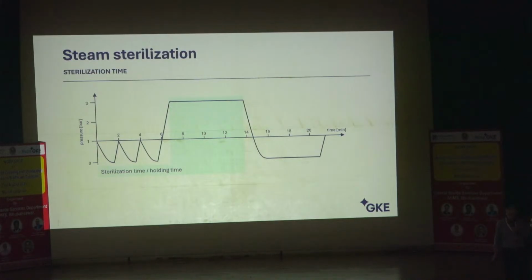Sorry. You can easily try this at home. Please buy biological indicators. Place 1 indicator strip in your kitchen, in your oven, and switch it on to 140 degrees centigrade, even hotter than your steam sterilizer, 140 degrees.